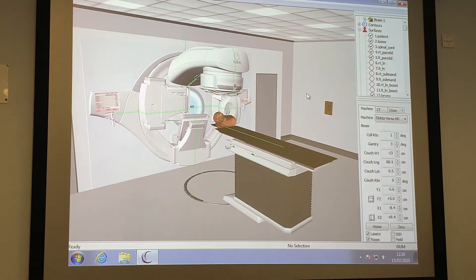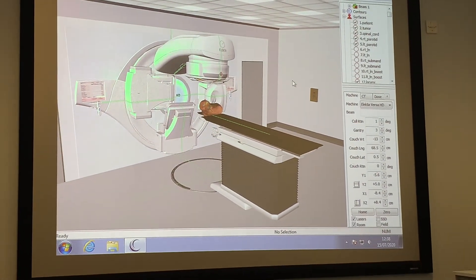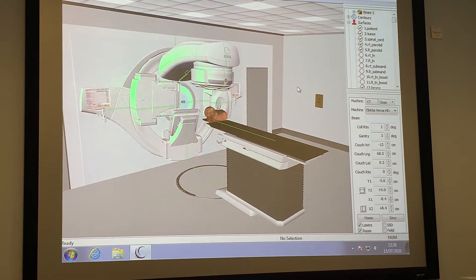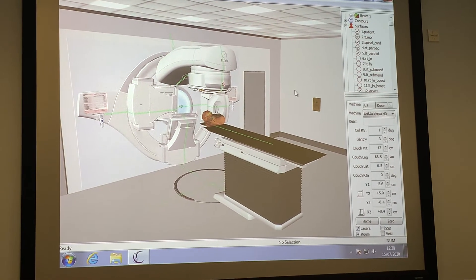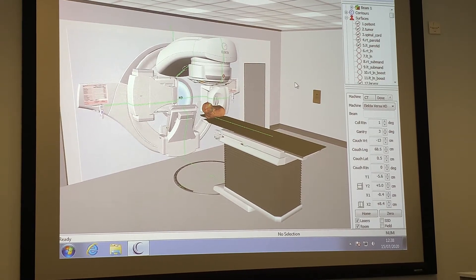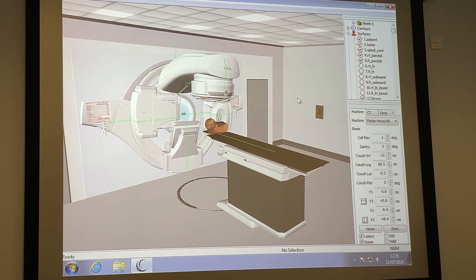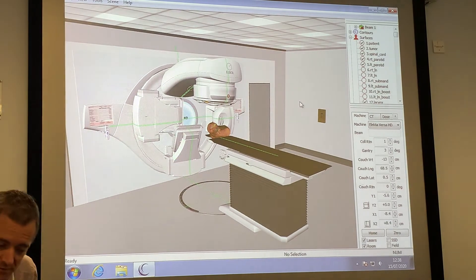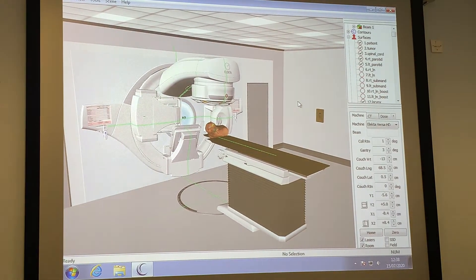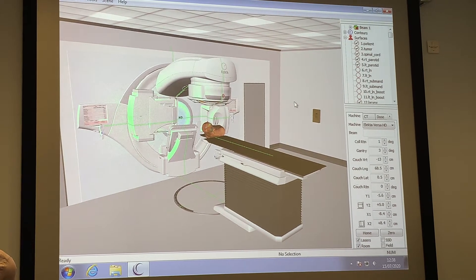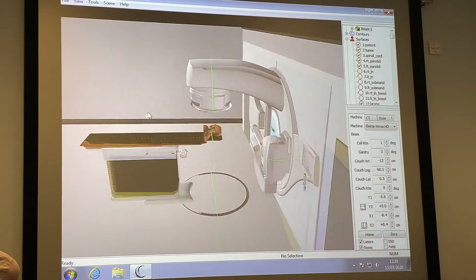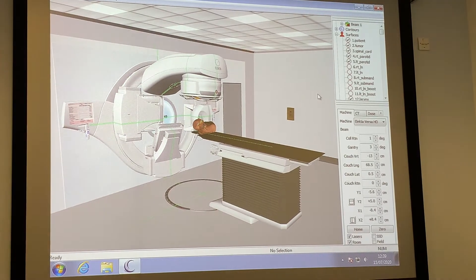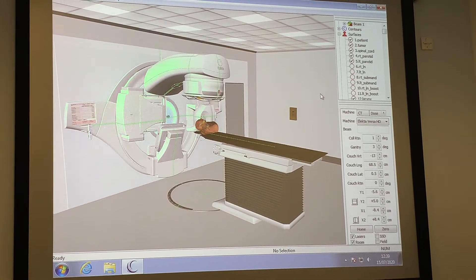On the screen in front of you, you can see a radiotherapy linear accelerator machine. This is housed in a treatment bunker. Radiotherapy treatment is a specialised service, so there are not that many radiotherapy centres in the country — just over 60. One of the reasons being that they are expensive to kit out and to protect staff, the public and patients. The walls here that house the machinery are all reinforced with either lead, concrete, or a mixture of both to prevent radiation from escaping the room.